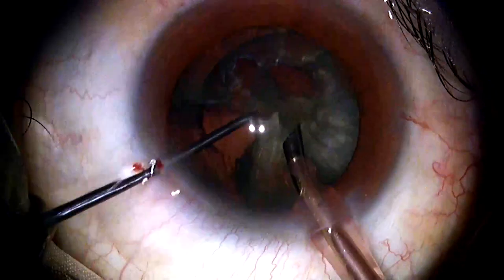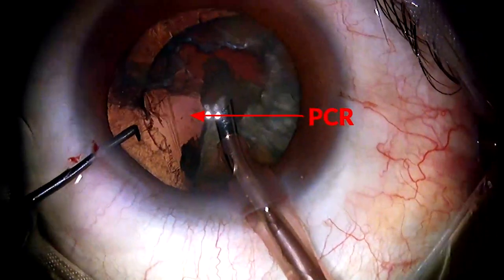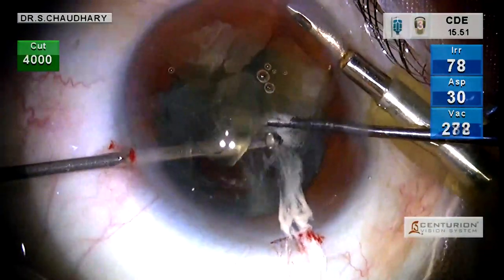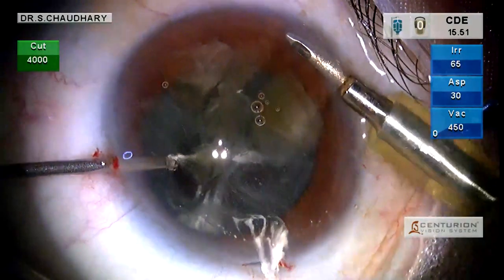The moment the PCR is detected, immediately fill up the chamber with viscoelastic before withdrawing the irrigation. Put in an anterior chamber maintainer, attach to a bottle height of 30 cm and do a vitrectomy.